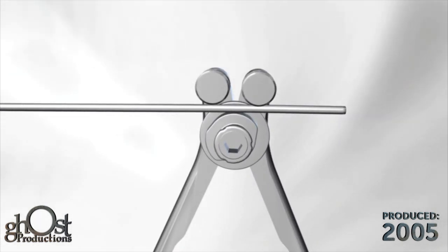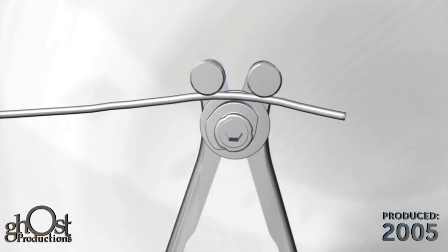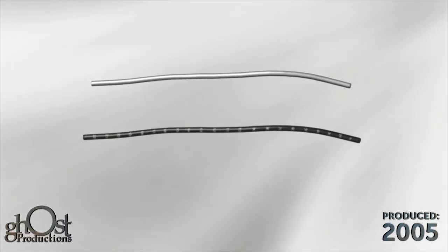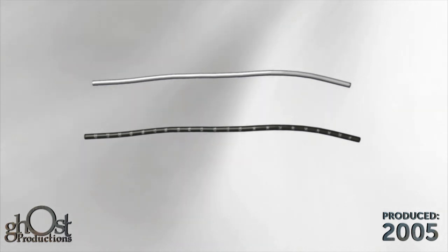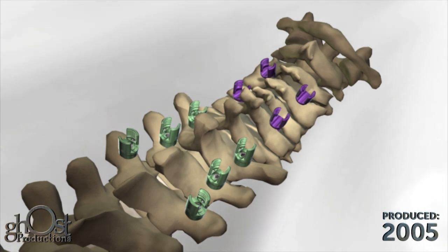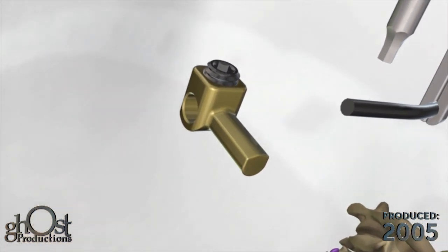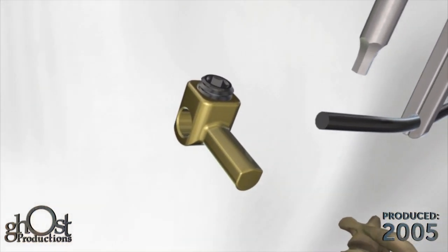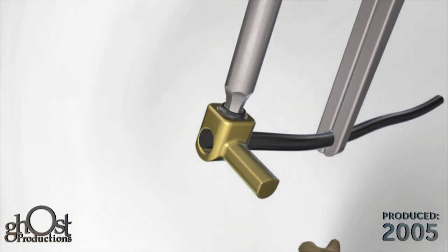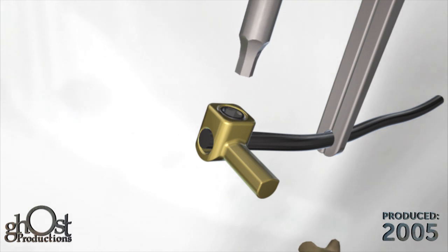The French rod bender may be used to contour the rod if necessary. Lateral connectors may be used to facilitate coupling the screws to the rod if necessary. To introduce the lateral connector, ensure the set screw is loose and slide the opening of the connector over the rod.